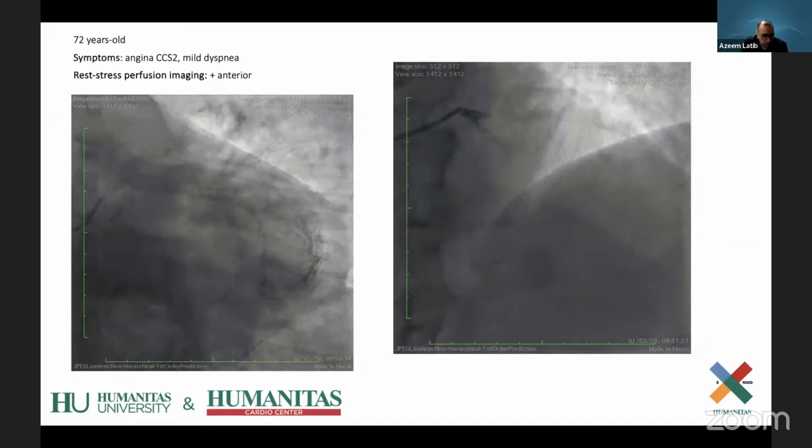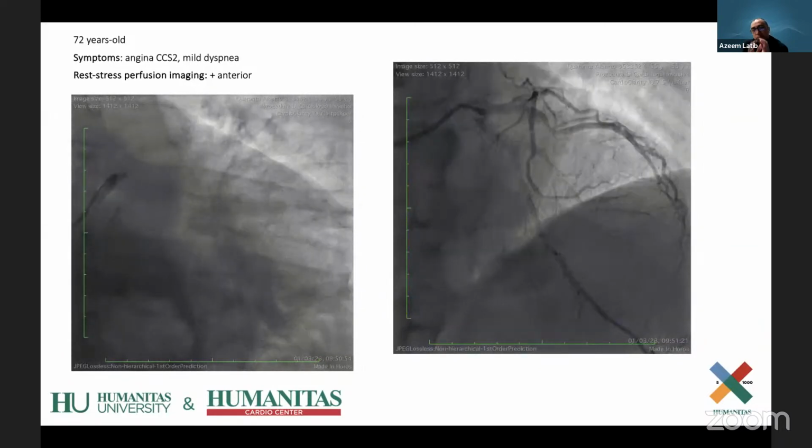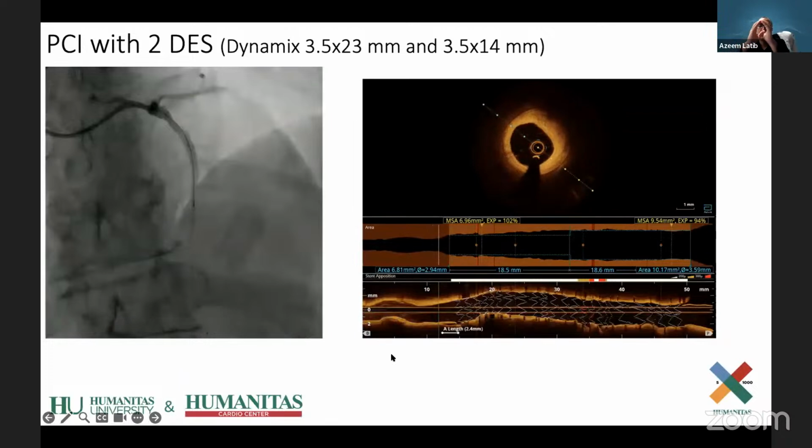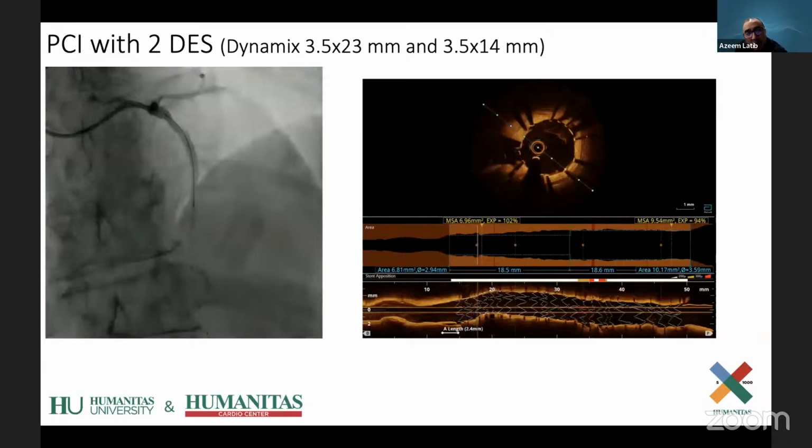And so, we used to have a lot of discussion, and I think it's important for the fellows to really understand, if you have a stent that looks very circular versus a stent that's more oval, doesn't matter if the cross-sectional area is okay. Now, there is some data saying it does matter. And the whole concept is if your stent is very oval, you get what's called non-uniform drug distribution.